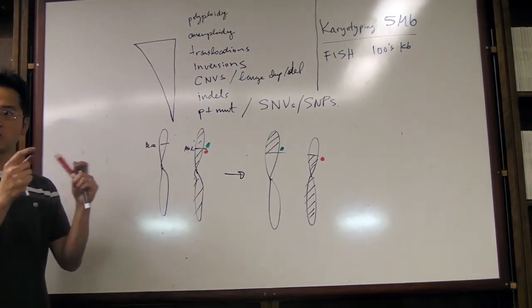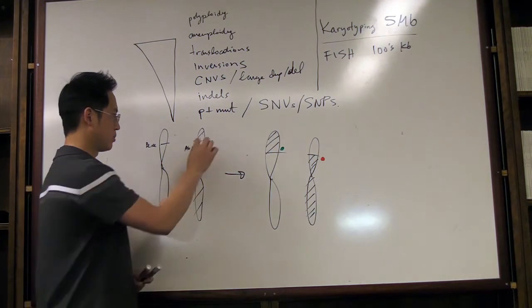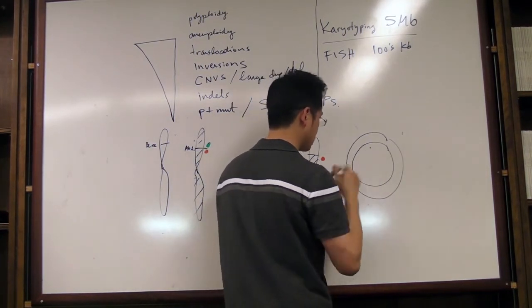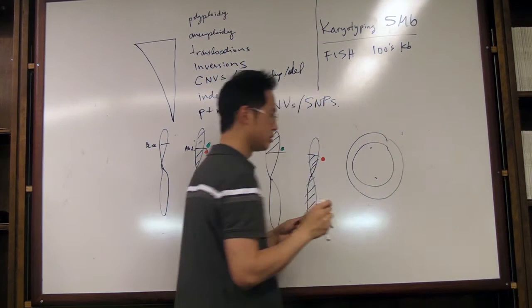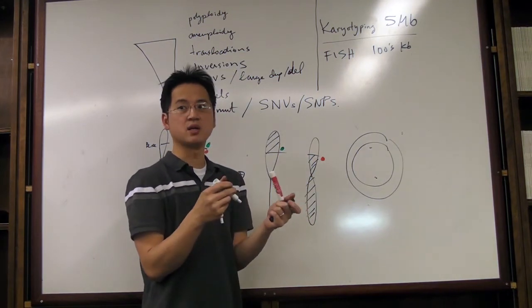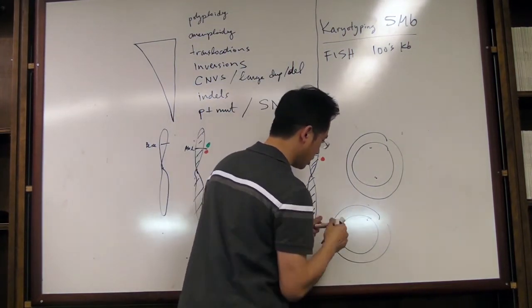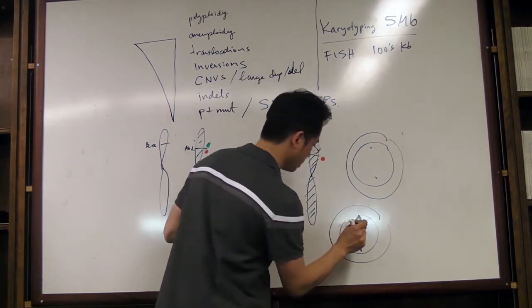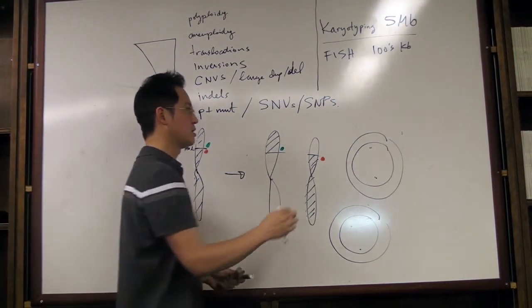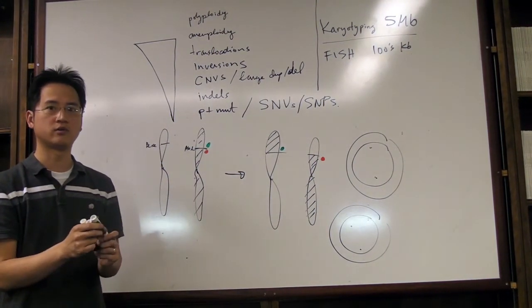Do you see now why location can give you some signature that something is happening with regards to rearrangement? So typically they will be together, so in a cell it will look like this. They'll be right next to each other, typically normally like that. Oftentimes they're on top of each other, and optically red and green makes yellow. So you'll maybe see a yellow signal instead of a red-green right next to each other. But in a positive cell showing translocation, you'll probably see one normal sort of germline copy, and then you'll see the other one completely apart, like that. So spatially, I can say that normally the signal should be together, but here I have a break apart event or a split event that tells me that there's a translocation involved here.